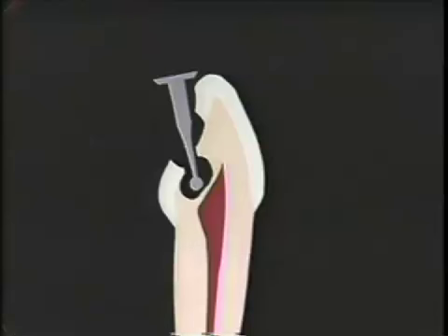Now this person is also having problems getting to the pulp. Is his problem a poor angulation, or searching blindly for the pulp, not having the confidence to continue on? It should be really obvious that he is searching blindly, gouging the tooth, looking for the pulp, and yet if he finds it, it'll only be by accident.